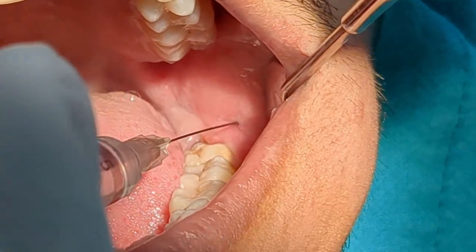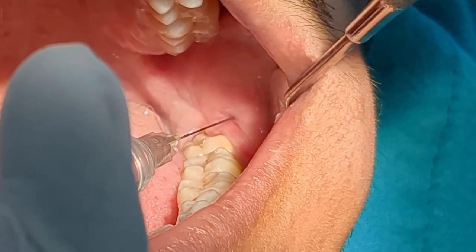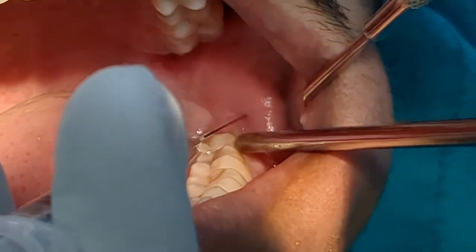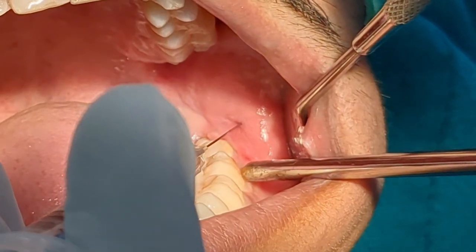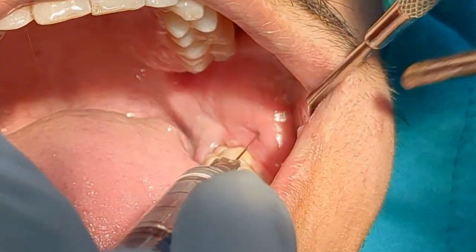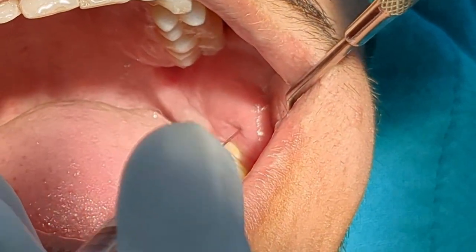One thing I would like to add is that usually I deposit 0.1 ml LA solution and then keep the needle in position without depositing any more LA solution. I let the 0.1 ml LA solution anesthetize the soft tissue for a few seconds and then I deposit the remaining LA solution for the buccal nerve block. This makes the buccal nerve block virtually painless.